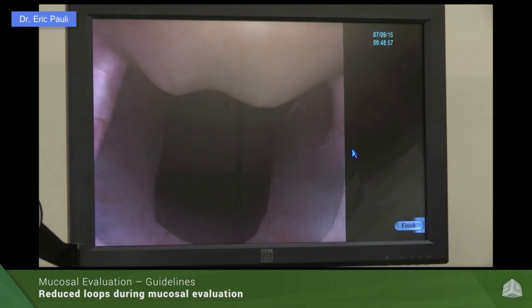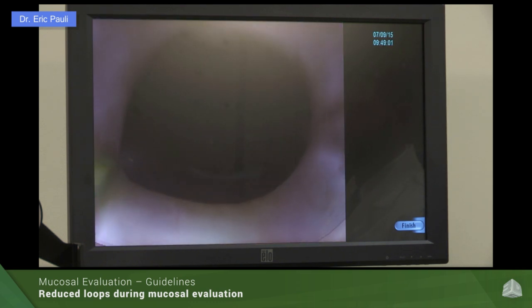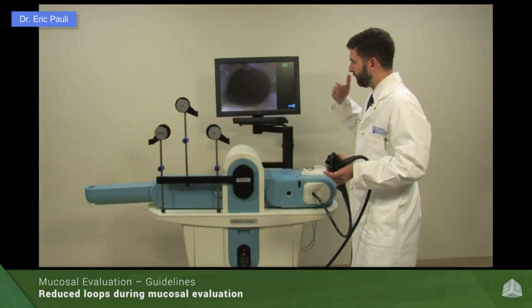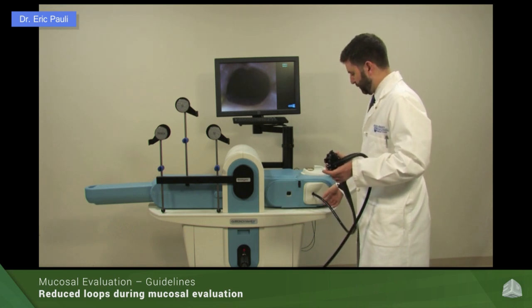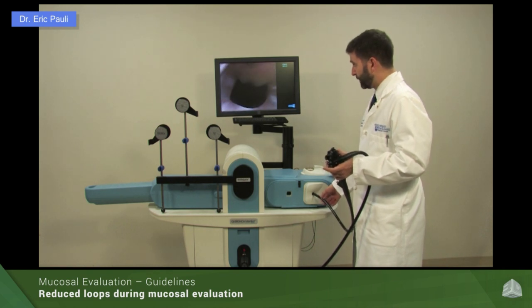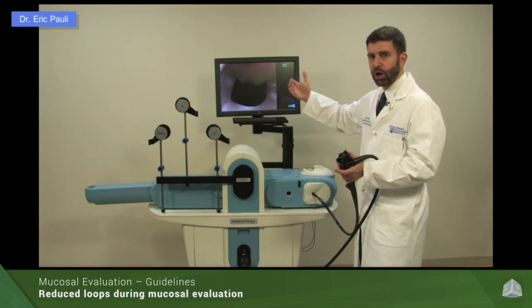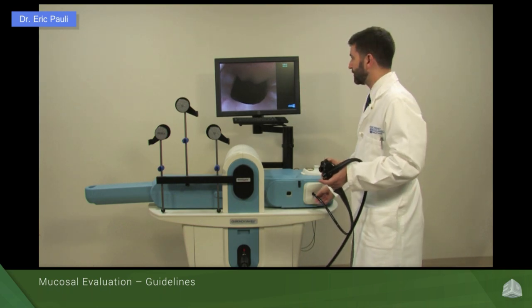We'll start our scope withdrawal — I'm going to keep my hand on the insertion tube as I do this. If we have a loop and it reduces quickly, we will see the colon fall back very fast. If that happens as you're reducing the scope, take your insertion tube and simply move forward a small amount — that will hopefully keep that loop from reducing substantially and prevent you from losing a large distance of advancement and incompletely evaluating a large segment of the colon.